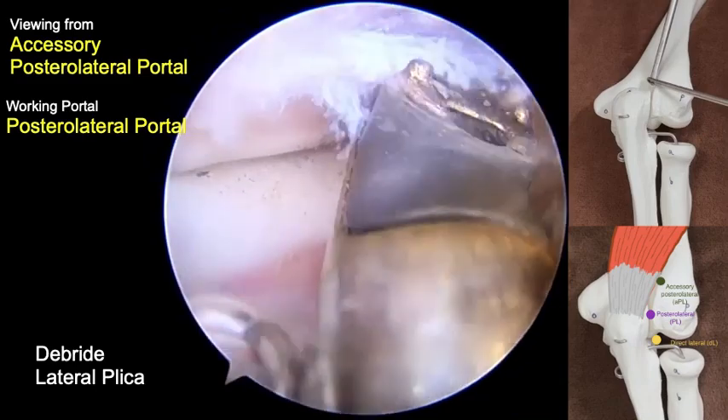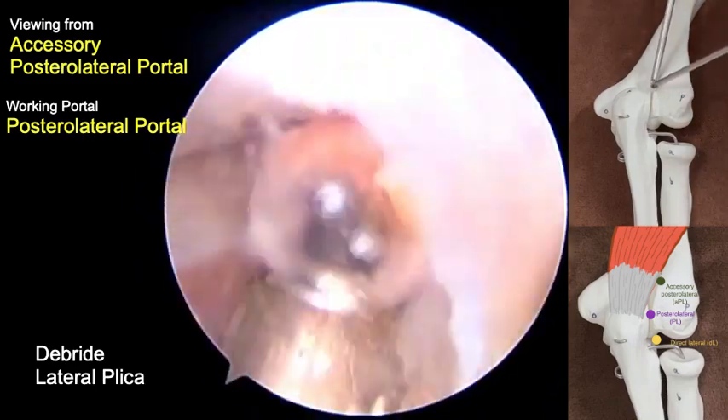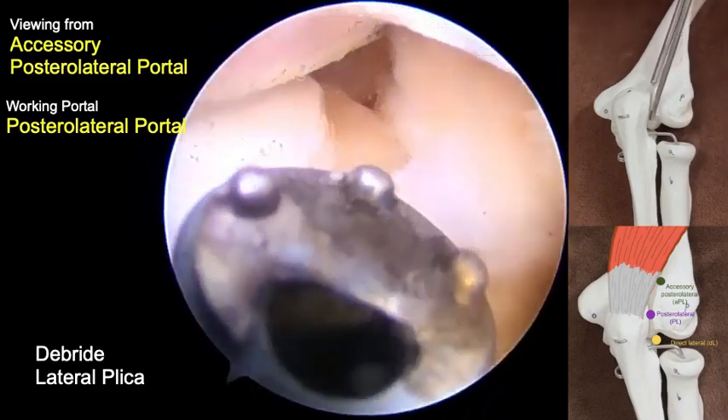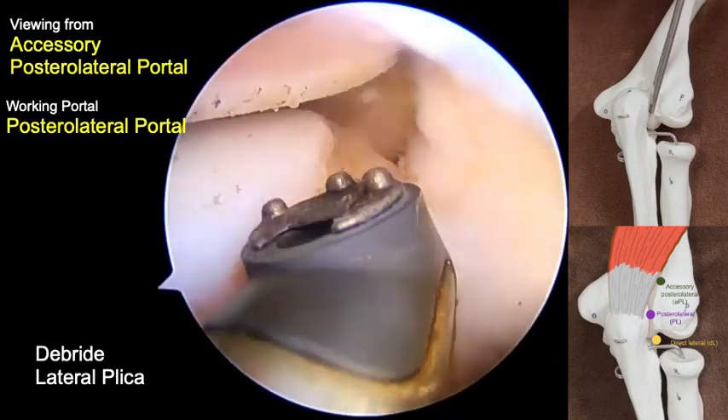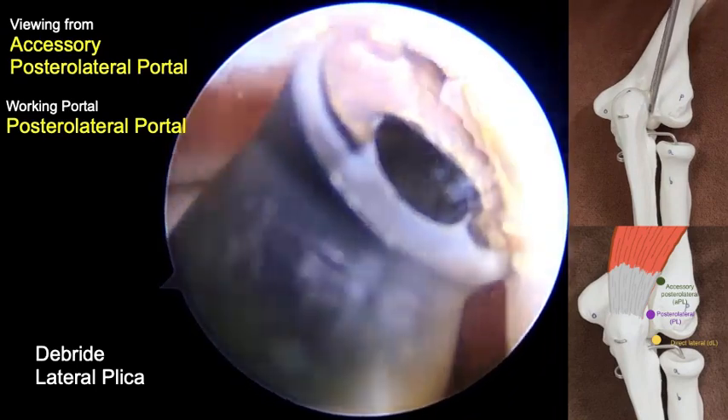Proceeded to the olecranon fossa area and the lateral gutter. Working in the lateral gutter, there is a potential jamming of the arthroscopic camera tip and the operating instrument because both are directed toward the lateral side of the elbow.